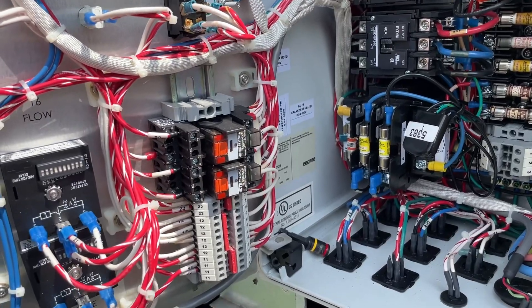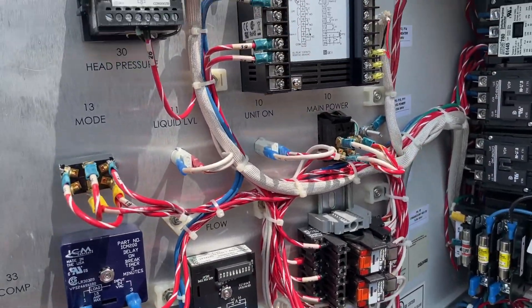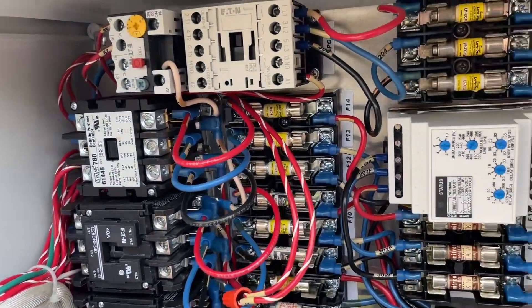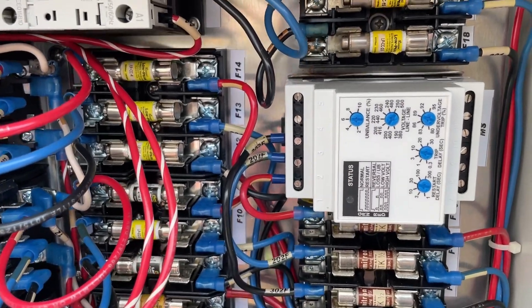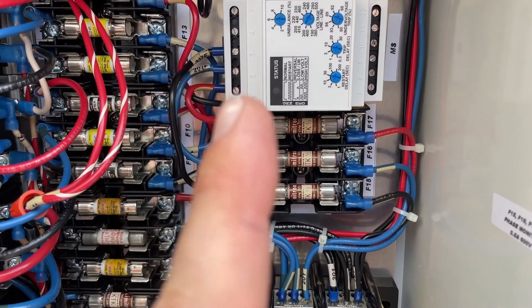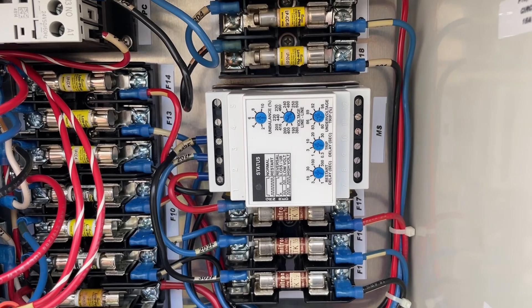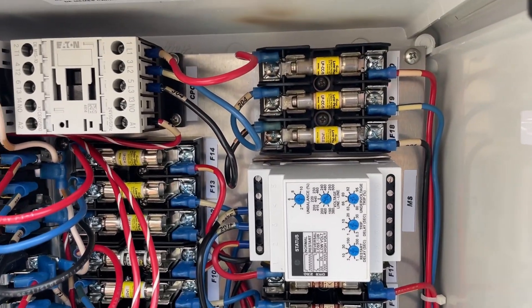Unfortunately, I've got no schematic on this, which isn't that uncommon in commercial, but I think a high-end unit like this should have it on a panel somewhere. I've checked out some stuff — got a transducer and I'm not seeing anything alarming, although I can see where something is burnt right in there. We've got power coming into this thing but nothing coming out, and I'm not sure that this phase monitor is doing much. I don't know if it was disconnected or what the story is.